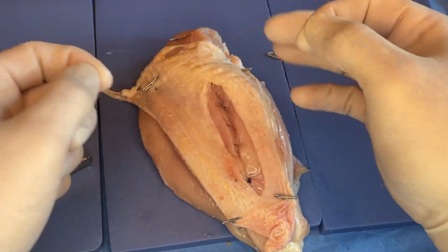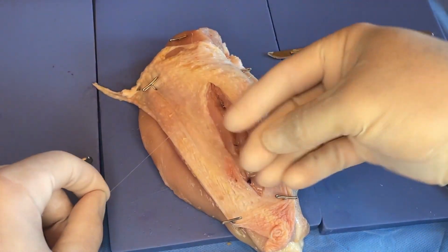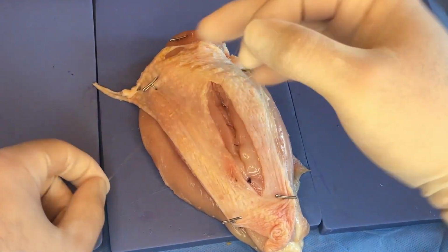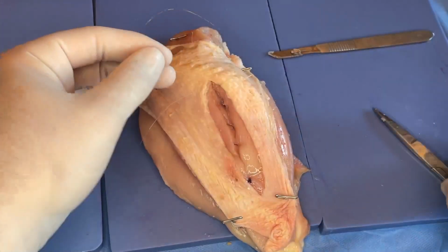I'm just going to do a one-handed tie here. So again, loop it over these fingers there, trap it, pull it through, over the index finger, pull through, over these two, through, finger, through. Fourth row is two complete square knots for monofilament.